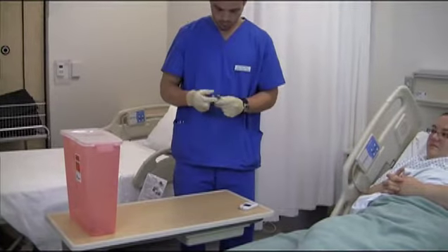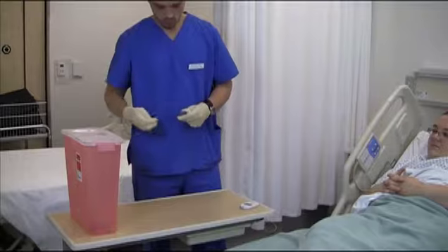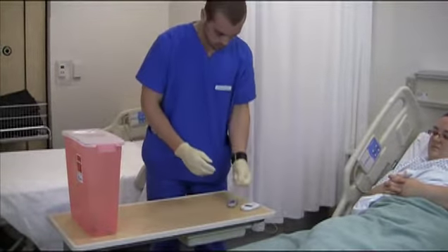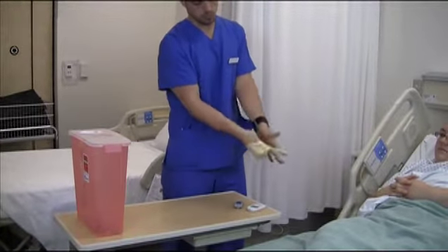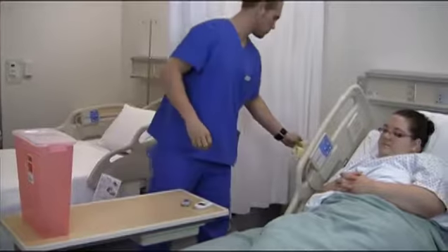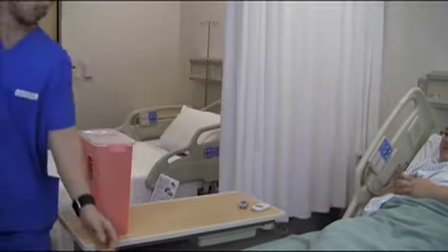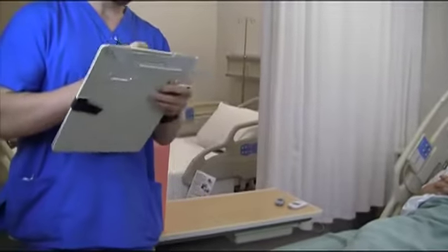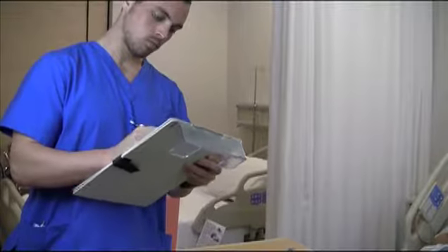Dispose of the lancet properly. Record results according to facility policy. Report results to the licensed nurse.